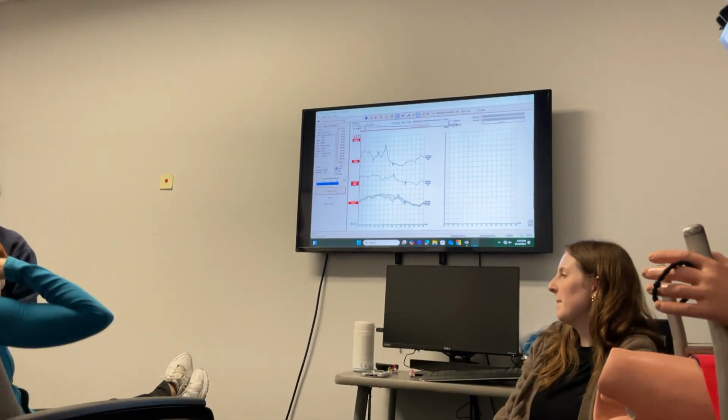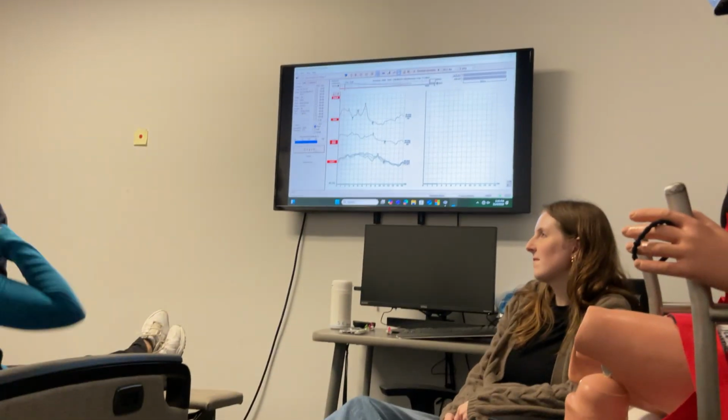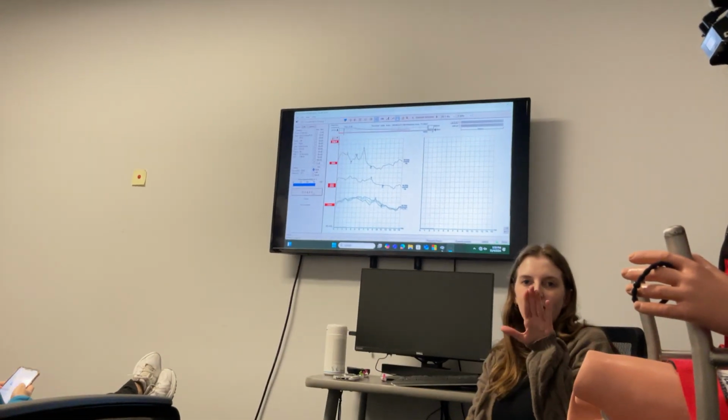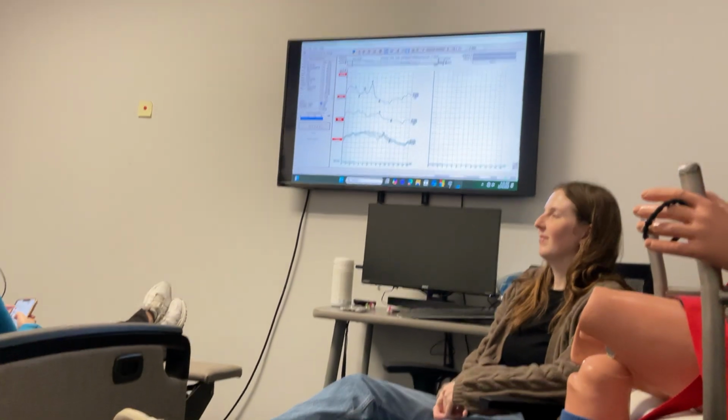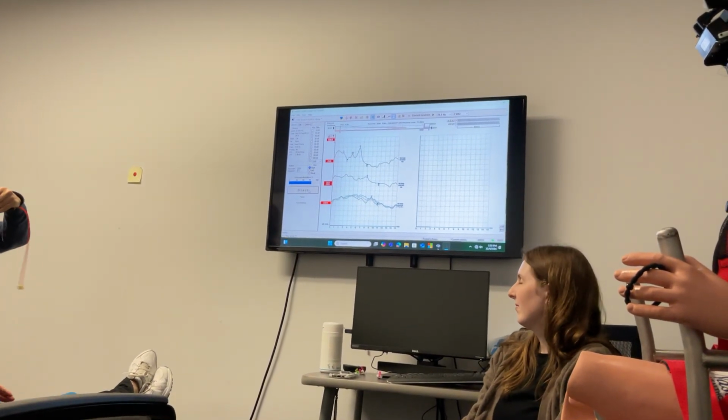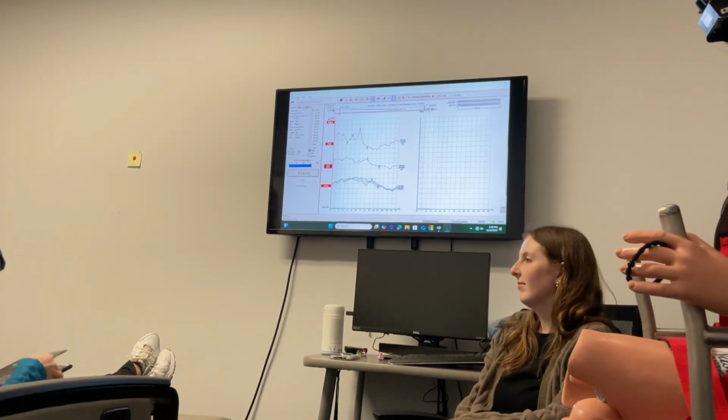Broadband chirp: if the name just says chirp, that means it's a broadband. If there's a narrowband or a 500 frequency connected to it, then it's a frequency-specific narrowband chirp. Okay. So there is some more detail about chirp.